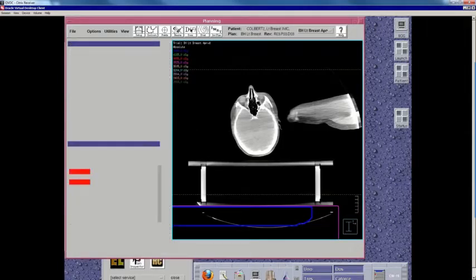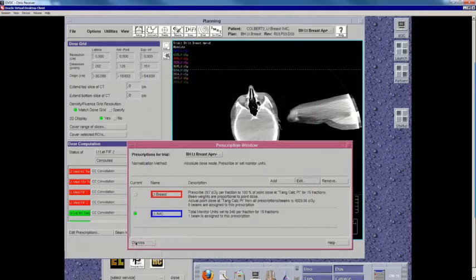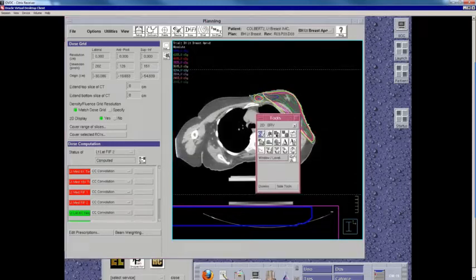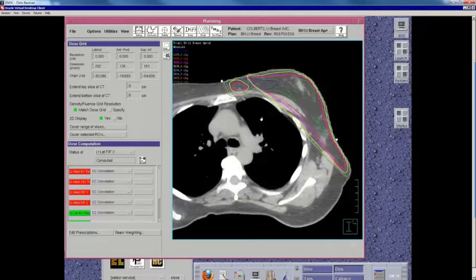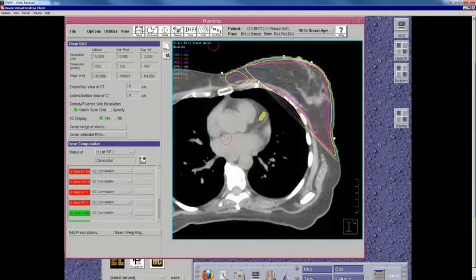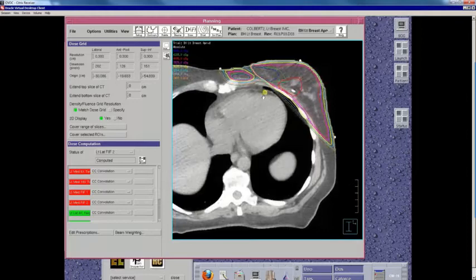And so now we can go back to review the entire plan by itself. So we're going to turn the IMC field back on. So 349. And now that beautiful tangent beam that the dosimetrist created has been ruined forever by this electron field, which is creating a not trivially sized hotspot in the breast. I'd have to say that's probably not the best thing for the cosmetic outcome. And I think patients treated like this probably have a little bit worse cosmetic outcome. But the real benefit here is that we've been able to get the LAD dose considerably lower.